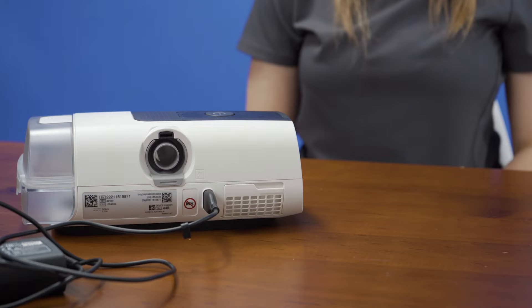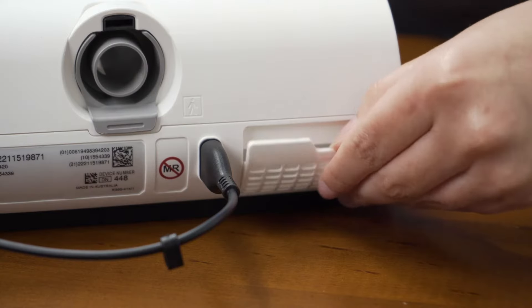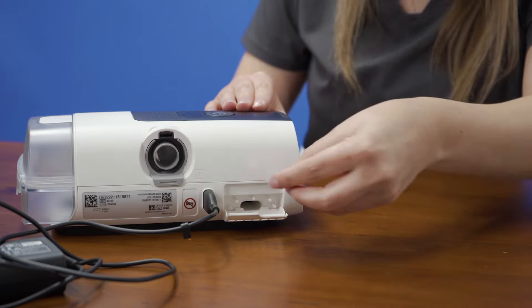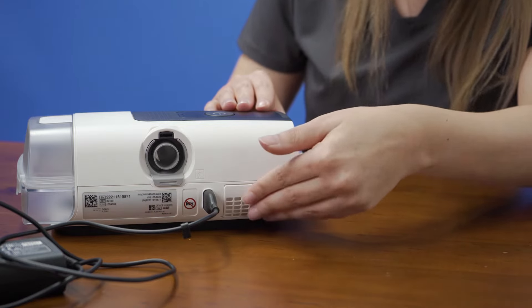If you look at the back of the machine, you'll see where the filter is located. There should be a filter already in place. To open this door, simply place your thumb on the tab of the door and pull down. To close, line the door back up against the device and it will snap back into place.